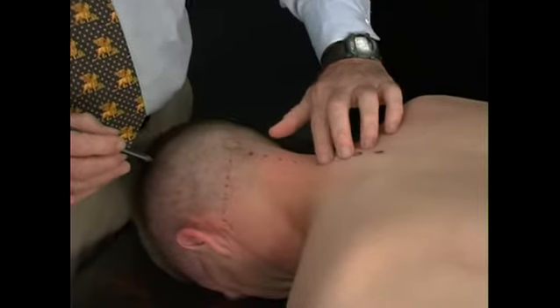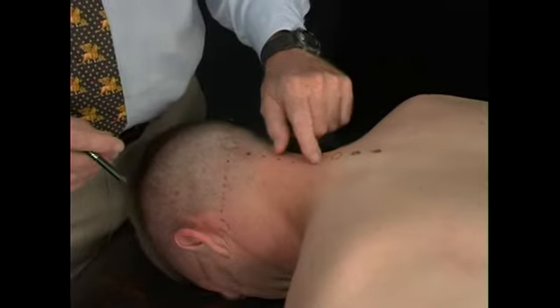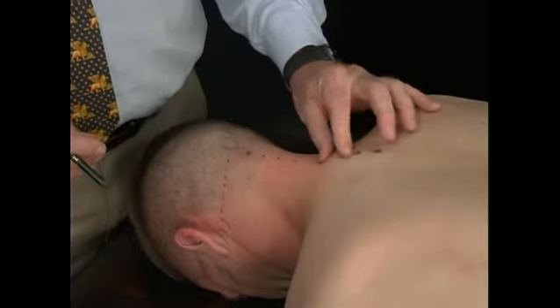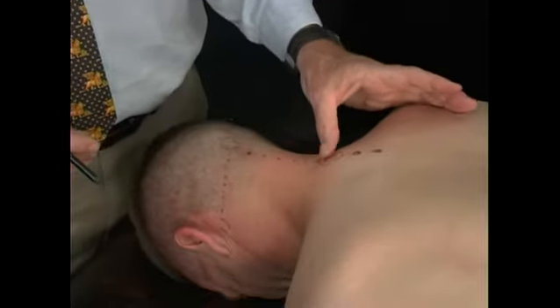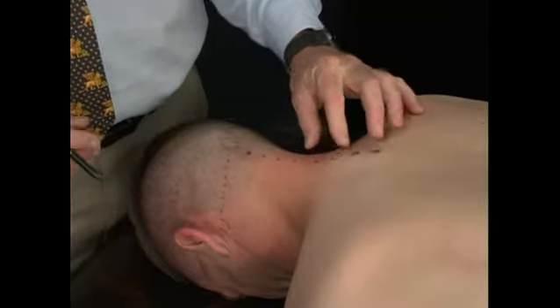And again, we're now down into the thoracic area. Sometimes it's difficult to tell when you're in the cervical area and coming down to C6 and 7 versus T1. And it is a bit difficult on this patient, but I think this is probably C6, probably C7 here. But we're not quite sure about that.